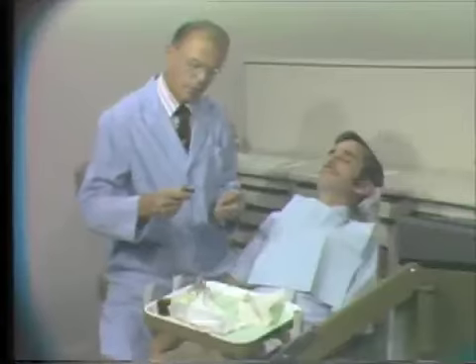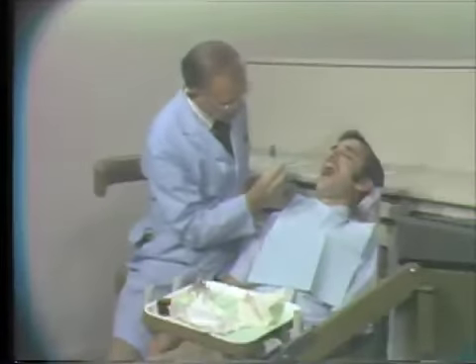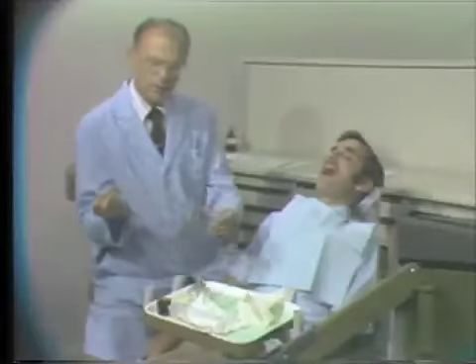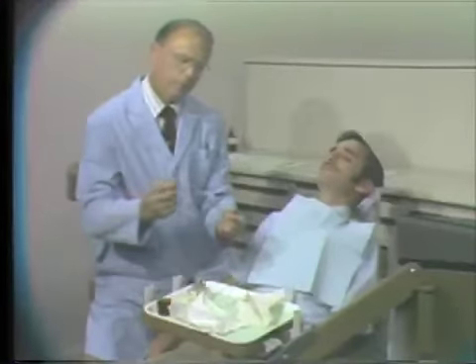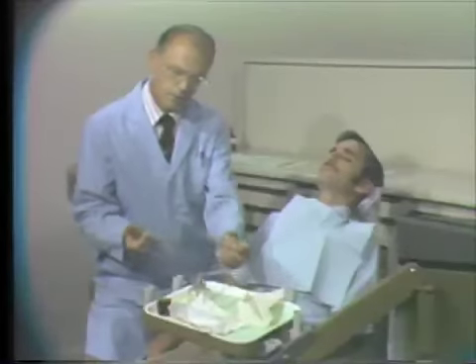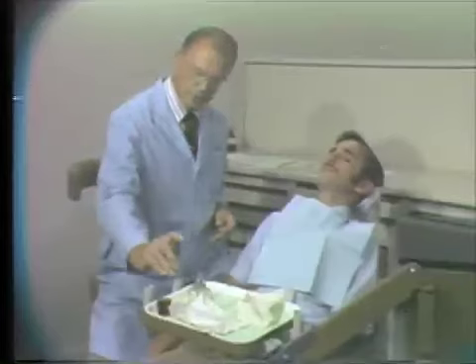And we will remove the applicator, go to the oral cavity, and swab from the same area and remove the specimen. Again, remove the cover, flame, place our specimen back in the sterile tube, cap it, and it's ready for shipment to the laboratory.